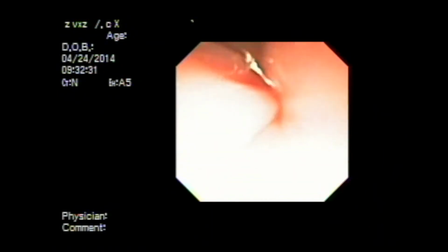When the pediatric scope is withdrawn slowly and with careful examination of the lumen, the mucosal tunnel can be observed, as well as the dissecting scope, which is seen here entering the mucosotomy on the anterior portion of the esophagus. In this case, the POEM tunnel dissection was straightforward. The tunnel was created with ease and extended onto the anterior surface of the stomach.